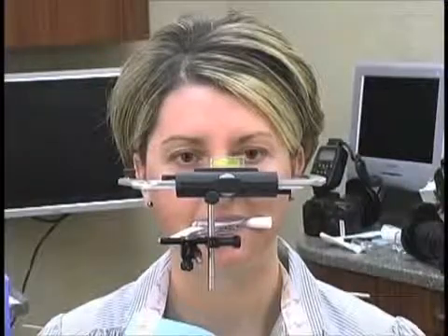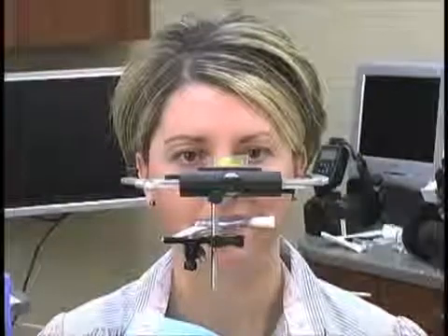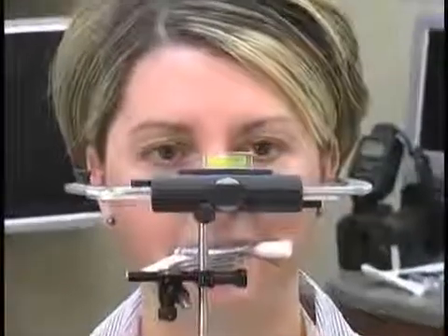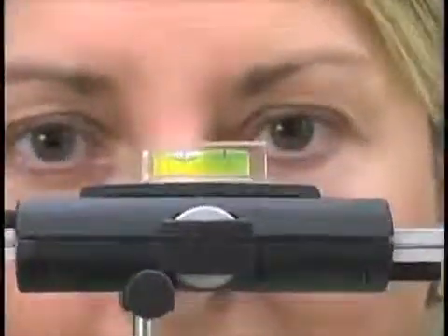Okay, with the patient sitting on the side of the dental chair now, what we can assess is making sure that the Facebow is level with the earth. And I want you to think about that, because when your articulator is sitting on a lab benchtop, in a laboratory, the top of that articulator is going to be level with the planet. Okay? And so it's important then that we understand that this Facebow has to be parallel with the top of the articulator. The only way to do that is to have some reference point.